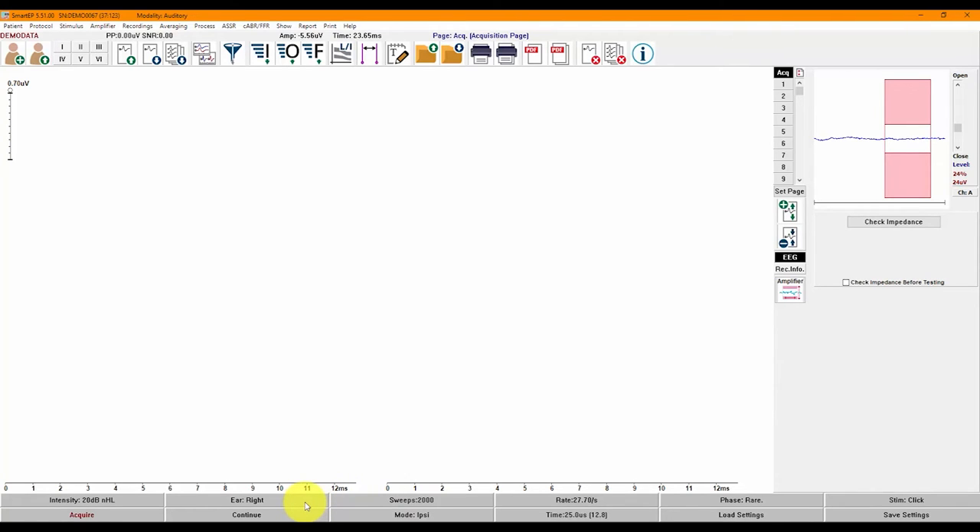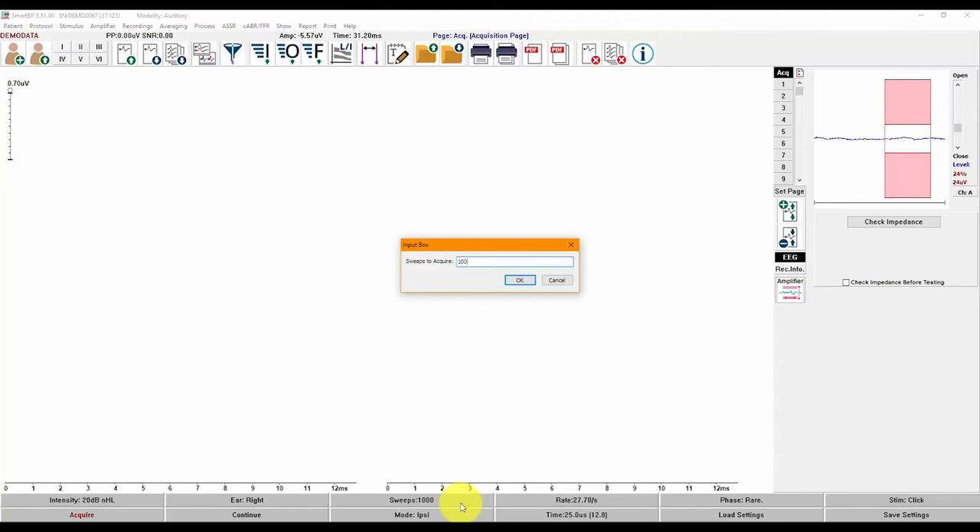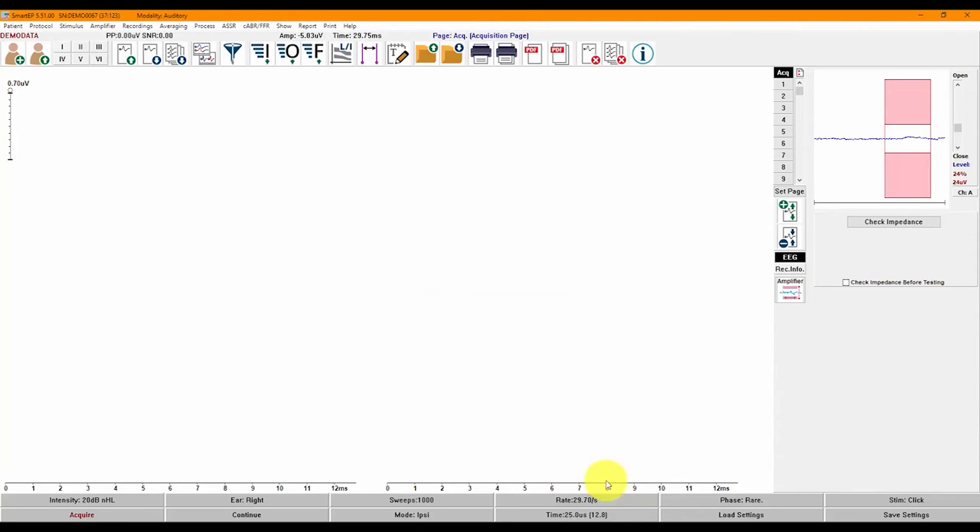For parameters with set options, simply click on the item to toggle through the available options. For example, with a single click on the Ear button, you can change from left to right or both ears. You can switch the polarity of the stimulus with a single click, going from rarefaction to condensation or alternating. For other parameters, you can double-click to enter specific values. To change the number of sweeps, double-click and enter a value, and the same can be done for the rate. Right-clicking on Intensity will increase it by 10 and a left-click brings it down by 10, or by the step size selected. You may also double-click on Intensity to enter a specific value.